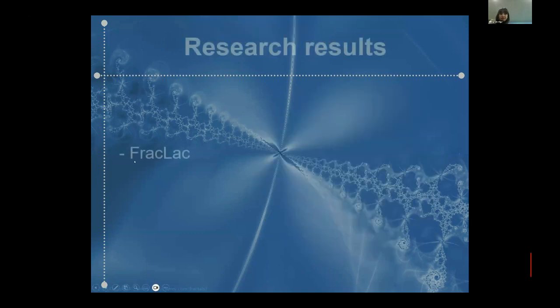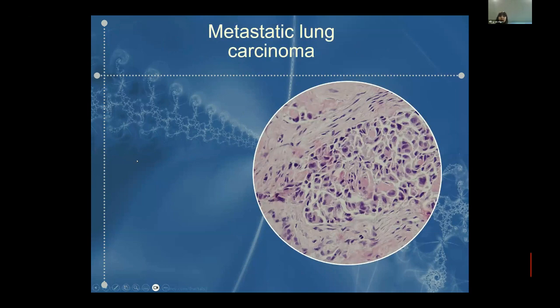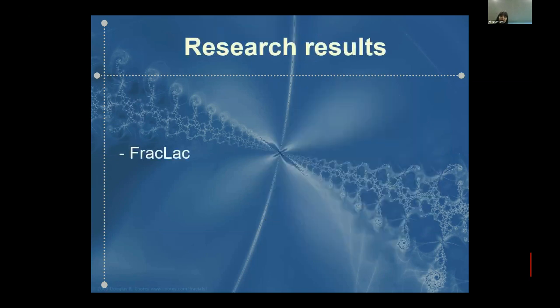And after that, it's not just applying those methods, maybe with counting, coloring, and others. After that, pathologists send the patients to other, maybe invasive, long-lasting and expensive diagnostic methods. And patients, especially with metastasis, don't have time. So in order to prevent that, to shorten that time and to increase accuracy, the idea was to apply algorithms like this.